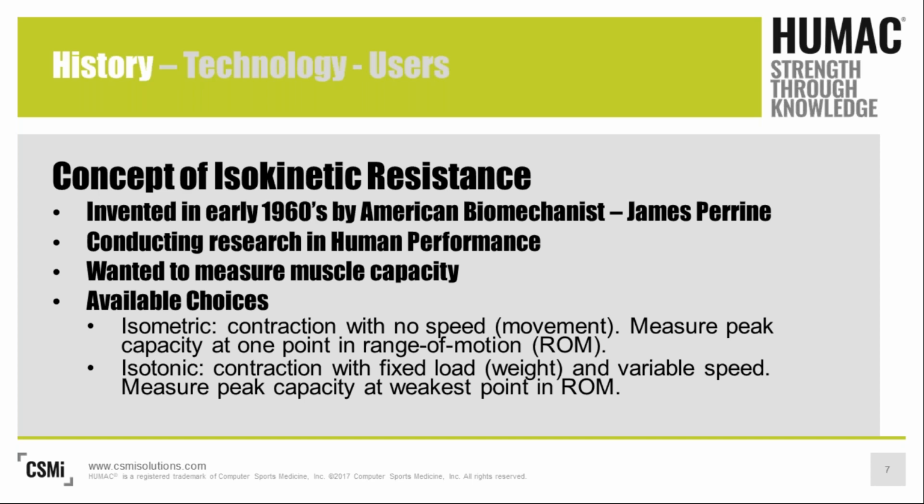Even though there's been a huge amount of new concepts for analysis that's been proposed, looking at force, work, and power are very important considerations in today's world. The isokinetic concept is significantly different than isometrics or isotonics.